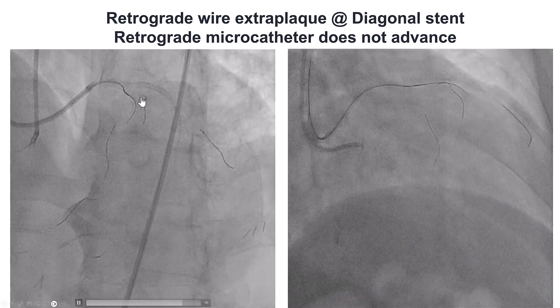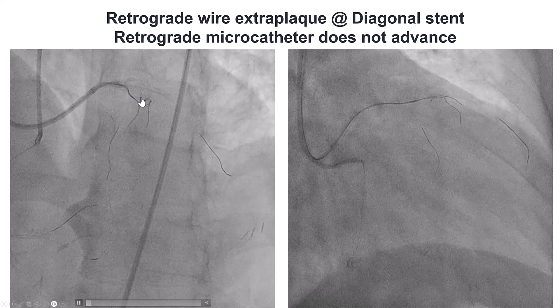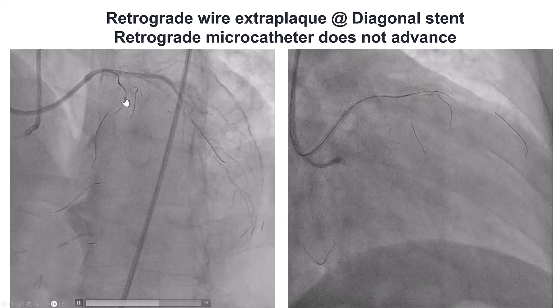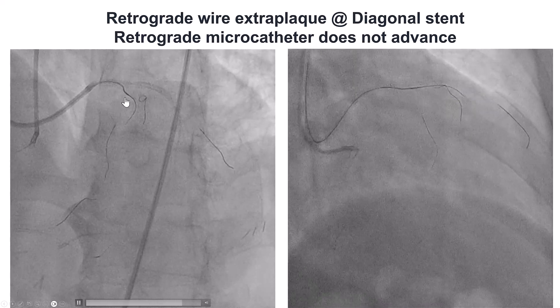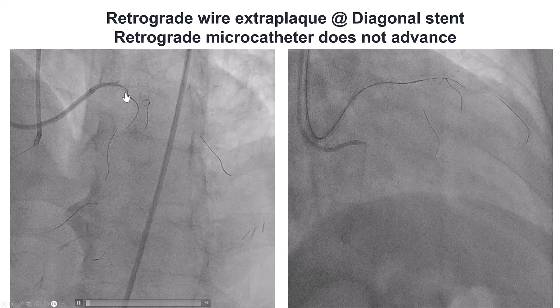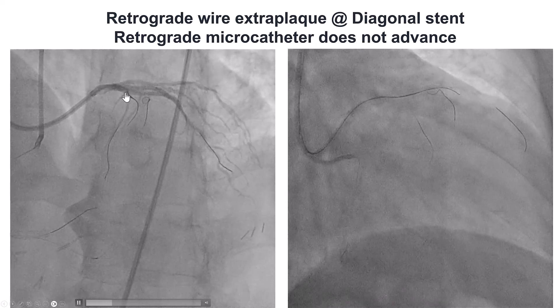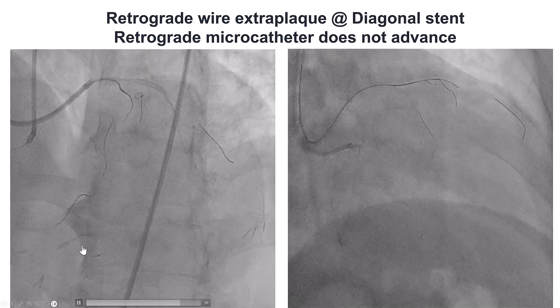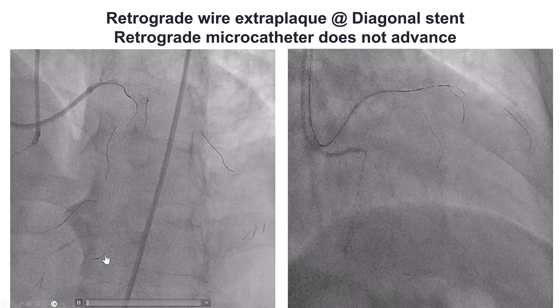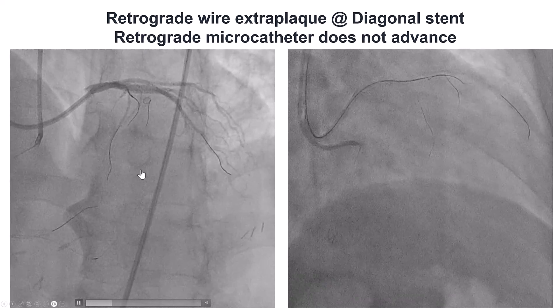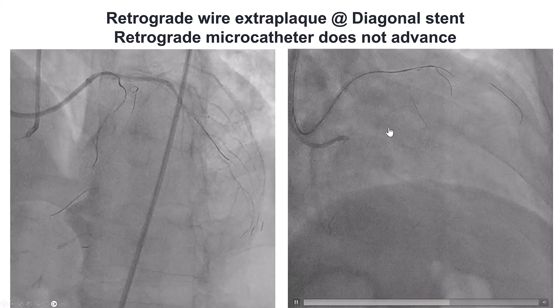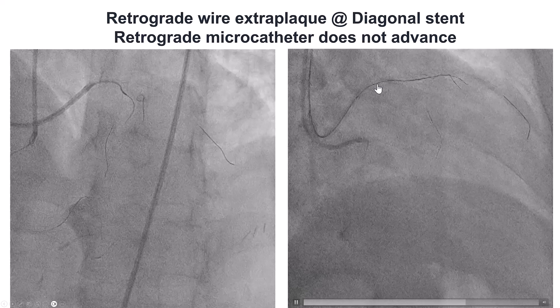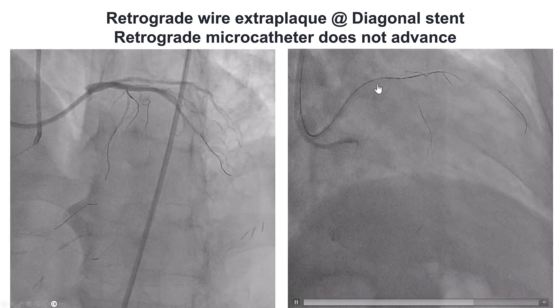This view now confirms that the LAD is located a little further out than where that previous branch was located. However, the problem we had here is that we could not advance the Caravel microcatheter all the way to the LAD to give us more power to try to puncture retrogradely.